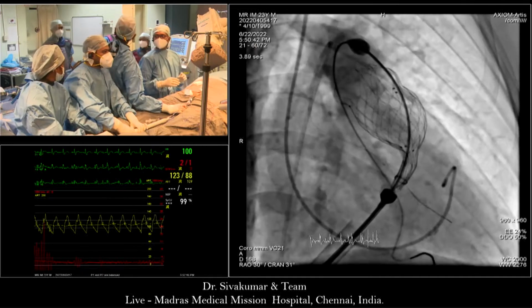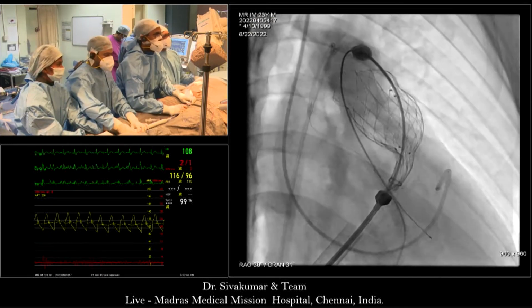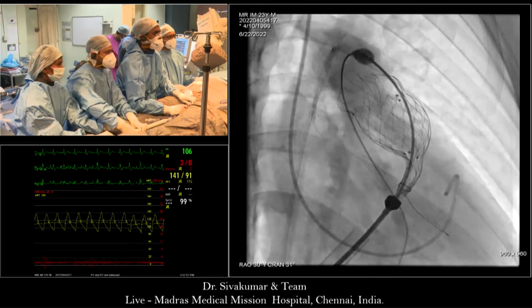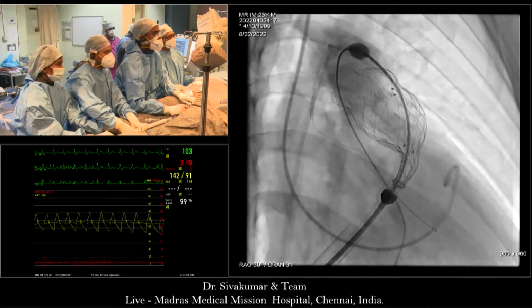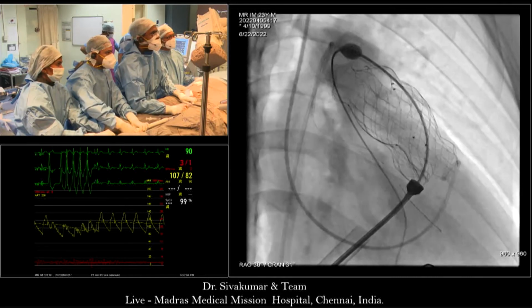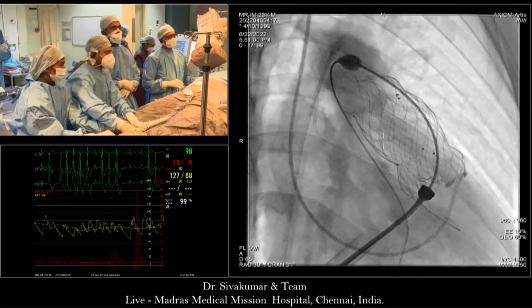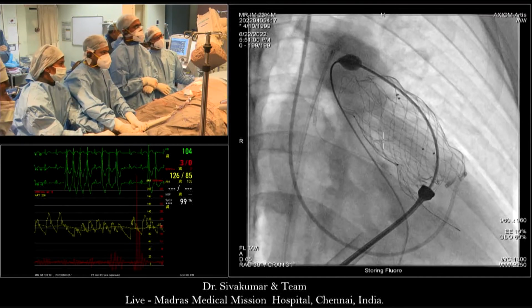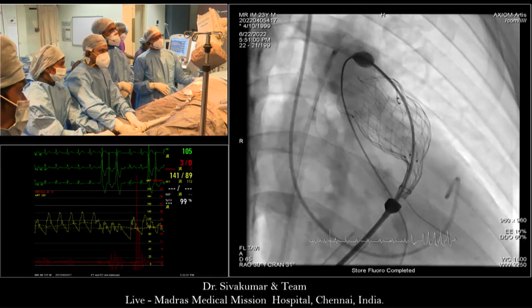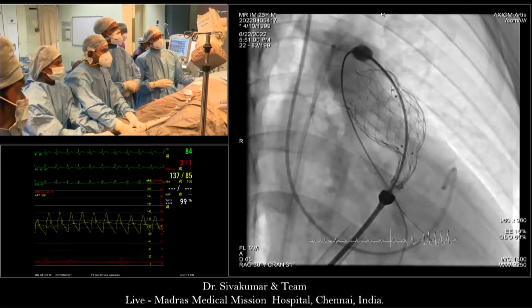The patient is fighting the ventilator, a little bit of sedation. Okay. Now keep slowly deploying. Yep. Okay. And store that because you'll see at the end the distal flare moves a little more proximal. Yeah, we have stored it.